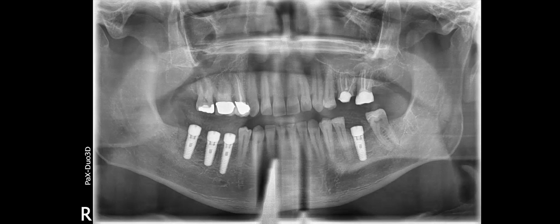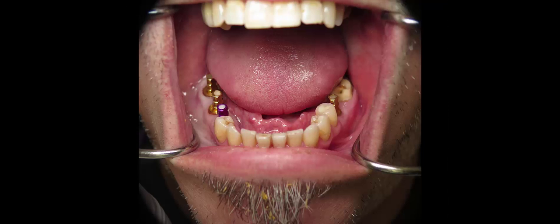This is the x-ray immediately postoperatively. You can see really large implants placed deeply into the jaw bone. They're going to last a long time.